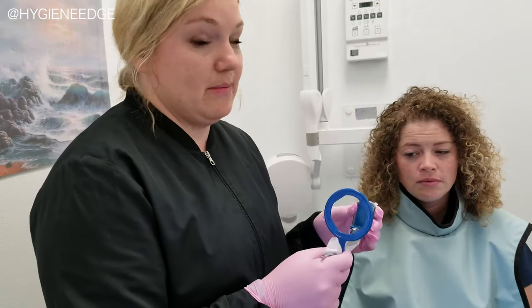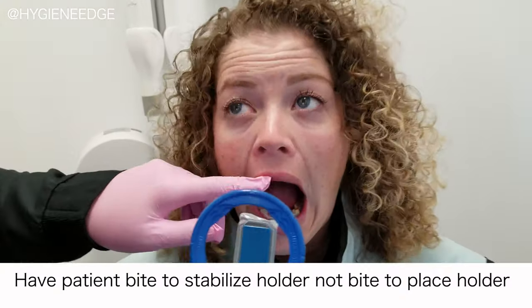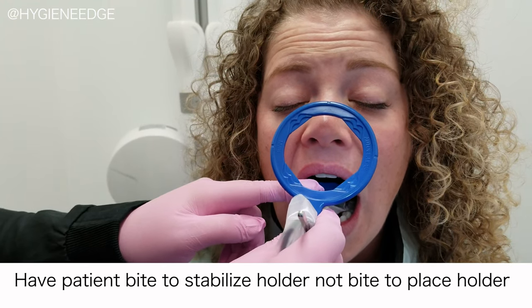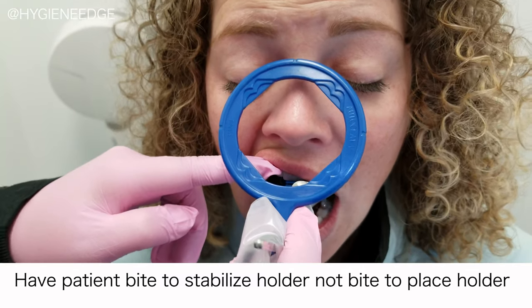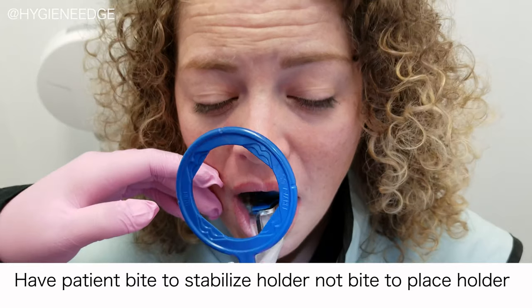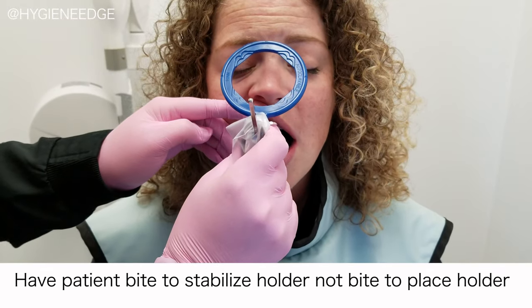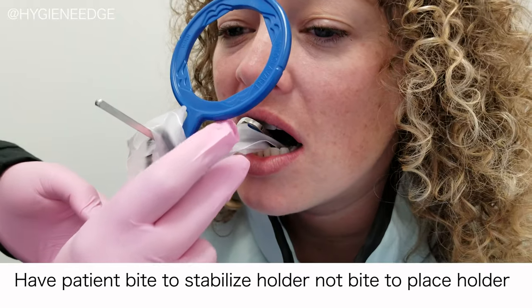Here are a couple tricks to prevent you from cutting off either one. Number one, have the patient open really wide and place the sensor exactly where you want it. Similar to the back, I always try to get the plastic — or metal or styrofoam — touching the target tooth first before the patient bites. If I just place it and have them bite, see how it just goes wherever it wants. I always place it exactly where I want it and have the patient close nice and slow, so it stays more parallel to the tooth we're working on.